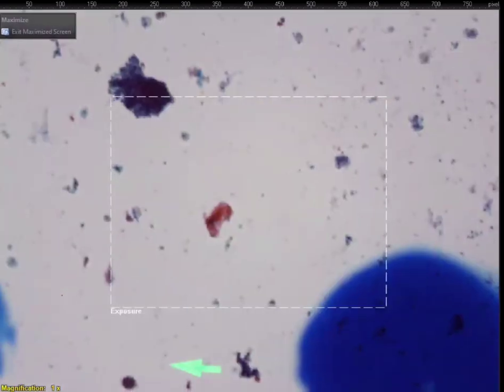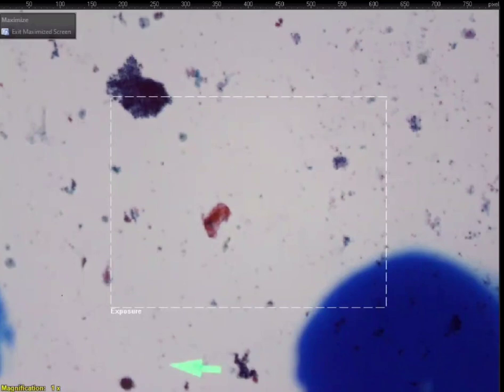Okay, so everybody comfortable with this case? Okay. Let's see what this one had. I don't think we looked at it. Again, it's just a random lymph node and no other info. Oh, this is a cell block. Mediastinal 4L node. So probably again EBUS.